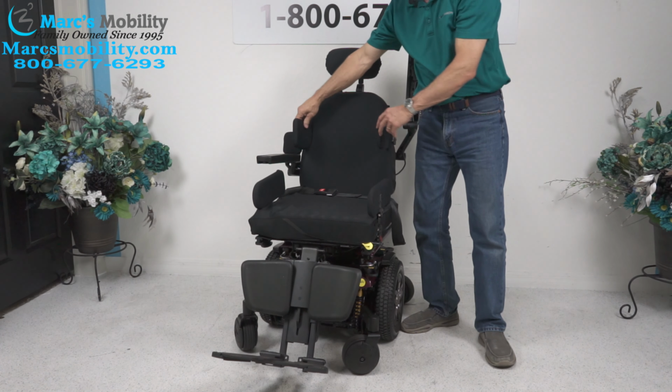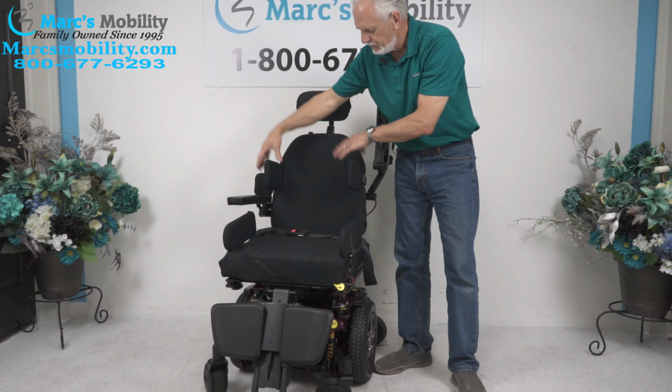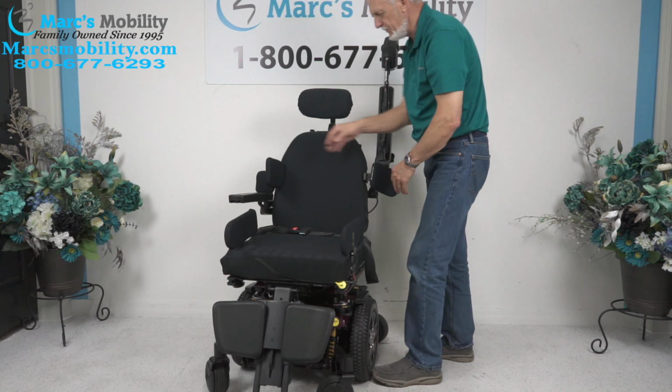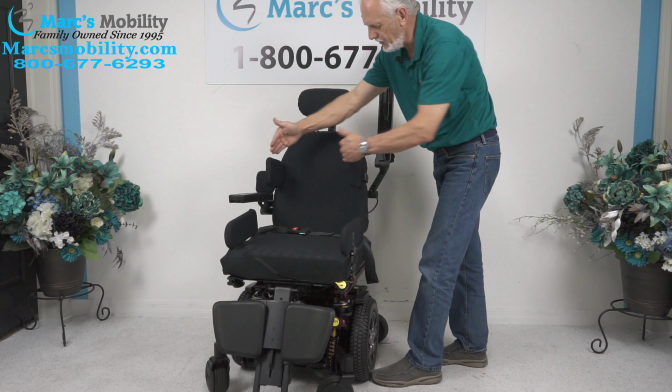You also have chest guard. All this can be taken off. So this will be on the chair if you buy it. But if you don't want these, you don't have to have them on there. This keeps your chest, keeps the person in the middle of the seat. These also can be moved out of the way when you get in, and they can also be adjusted in or out.